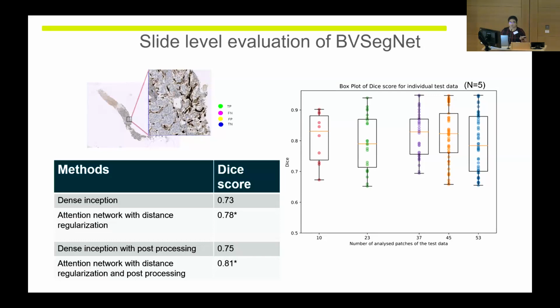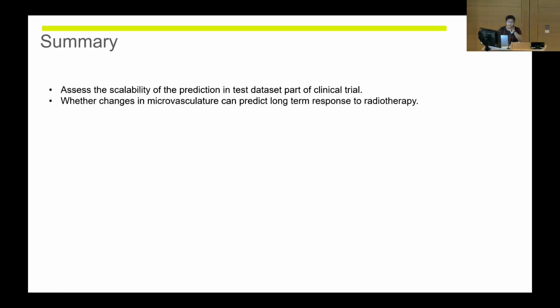Because if you add the negative regions, they are already part of the blue regions, if you remember the segmentation overlay, so that will always be 1. So it will skew your results. So I'm showing only those regions that had blood vessels, because we know where the ground truths are, so you can exactly compute what the Dice scores are for every patch that we have.